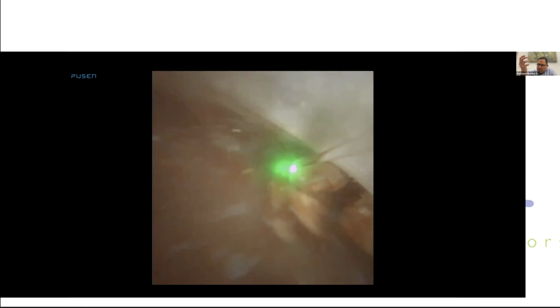So that's another advantage. When you use suction, you can manipulate the stone to come closer to the end of your scope. And then once you've done that, that's a stone in view. Again, I'll use intermittent suction to keep getting the stone closer to me because the system is dilated. So you can use the suction to your advantage. As I'm doing it, I intermittently suck so the stones keep coming close to me. So especially in a dilated system, this can be quite useful.